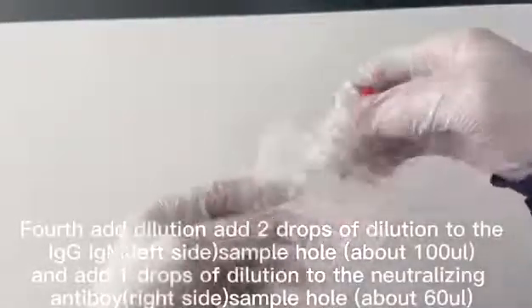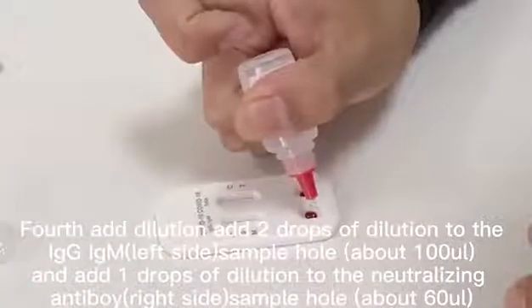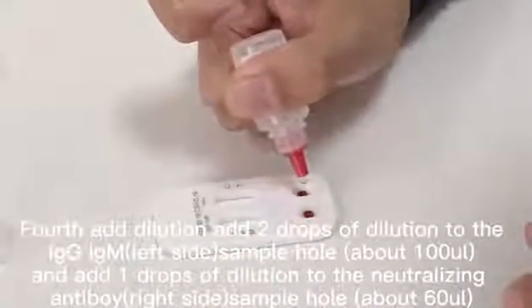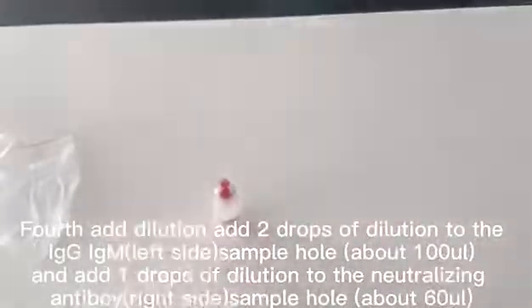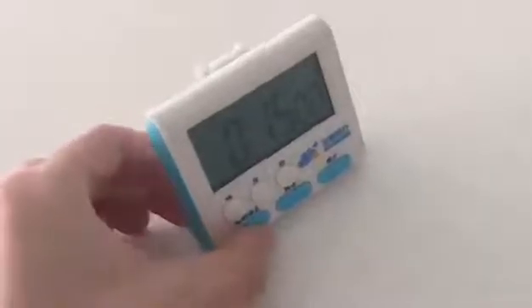Add 2 drops of dilution to the left side sample hole, about 100µL, and add 1 drop of dilution to the neutralizing antibody right side sample hole, about 60µL.